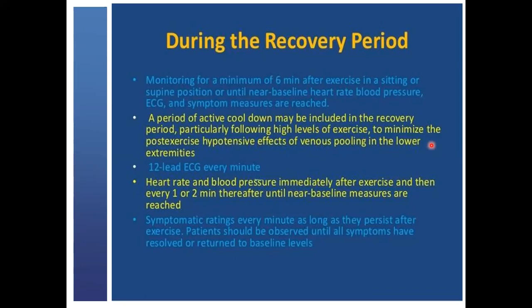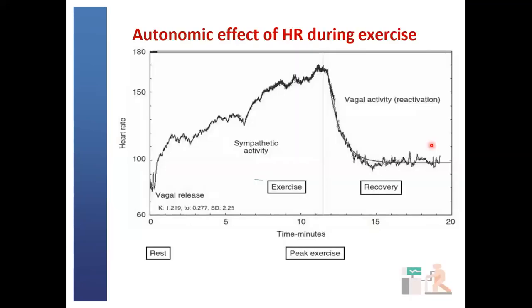So like I mentioned, we need to be monitoring our 12-lead ECG, we monitor the heart rate, we monitor the blood pressure every 1 or 2 minutes, and also monitor the symptoms of this patient. Particularly the heart rate and blood pressure in this recovery period, and also the ECG findings, are very, very important prognostic indices for us in making the diagnosis.